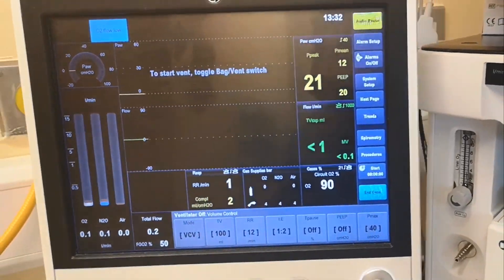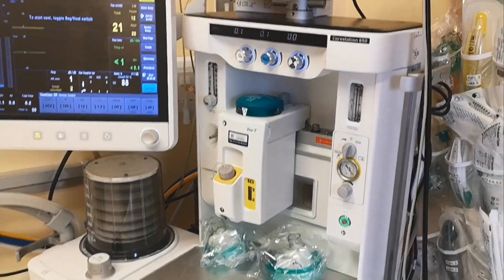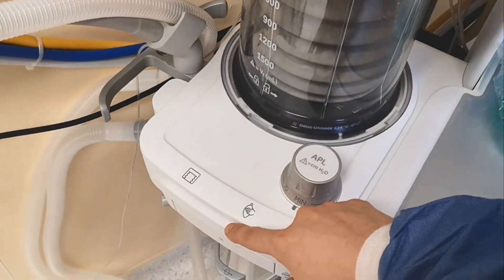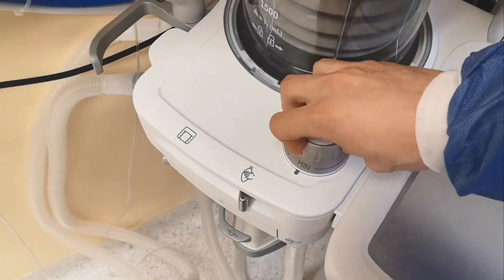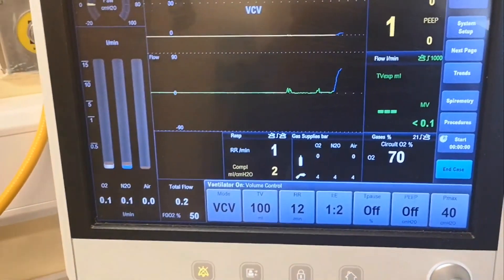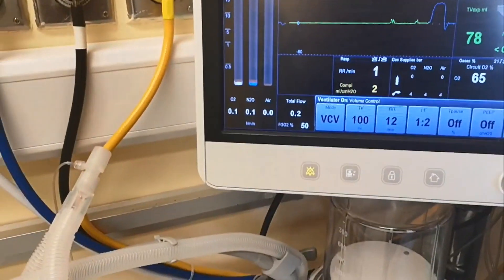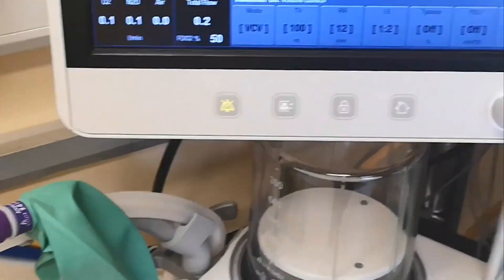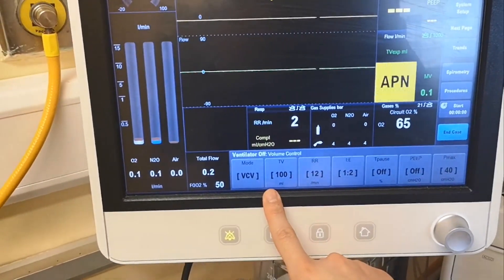Remember this is an anesthetic machine, we use it in theater. Just like the other machine, the Avance, you have two modes: manual mode with APL valve closed and you squeeze the bag, or ventilator mode where you set your ventilator settings. Let's put the bag on the Y — there you go, magic bag. Volume control.